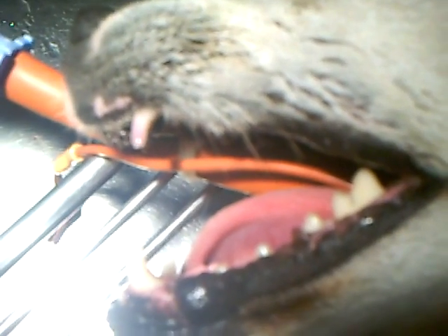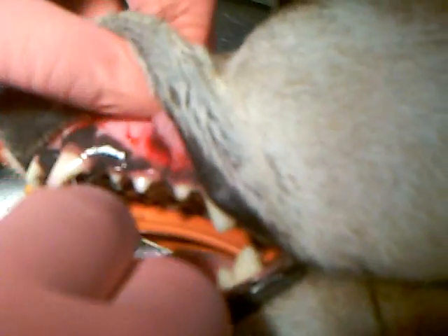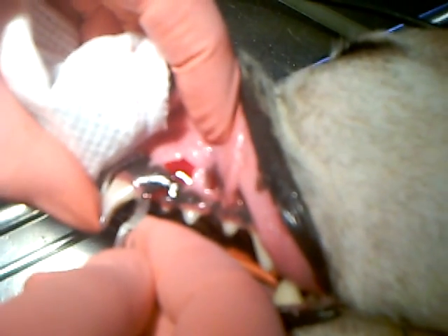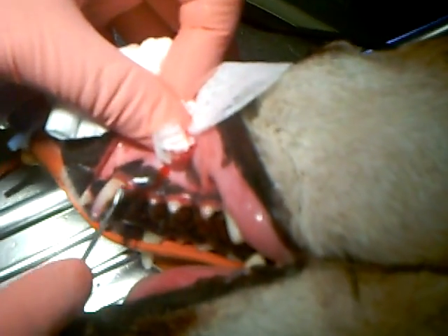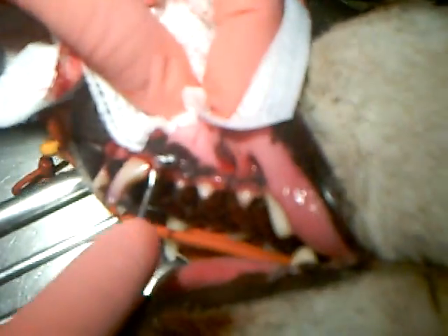Next thing we're going to do is we're going to make a flap into the gum tissue itself to expose the root of the tooth, and the root of this tooth goes all the way back about this far in this dog. So we'll make an incision and that's where we're going to start lifting our flap from. I'm going to take this periosteal elevator and just start to lift up this gum tissue a little bit at a time.